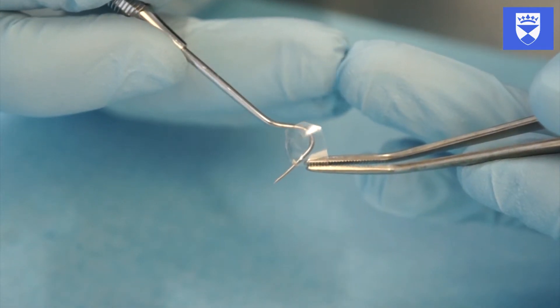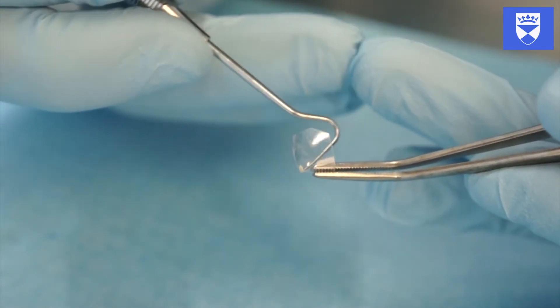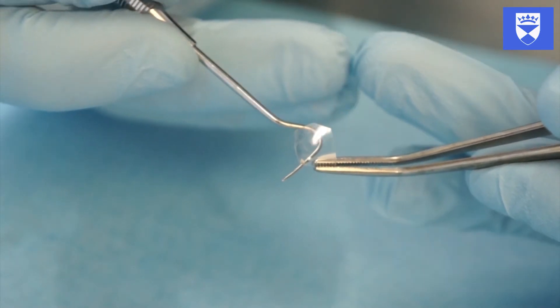Place a pinhole with a diamond burr or sharp probe at the corner of the incisal angle that is being restored. Placing a hole at the incisal angle allows excess material to be extruded and prevents the formation of air bubbles and voids.